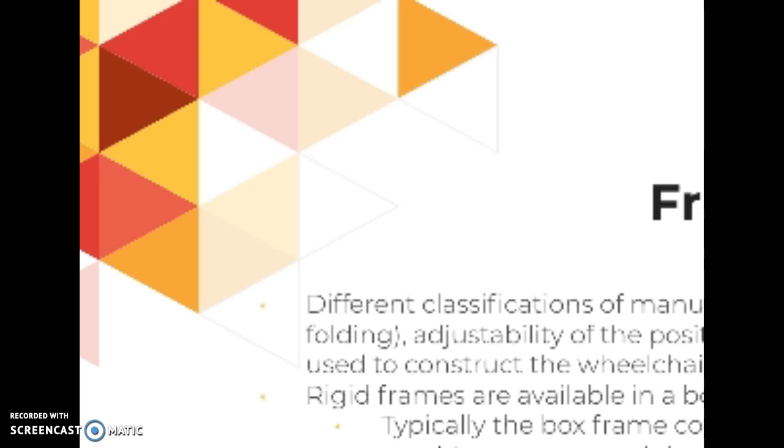Lighter weight designs are accomplished by replacing the box with just a single bar between the wheels, forming the cantilever structure. The T construction uses a bar similar to the single bar, but it has the single bar attached to the center of the cantilever that continues to a single front caster. So it forms the T shape instead of just the single I shape. So if the two front casters are used, then the T becomes the I.